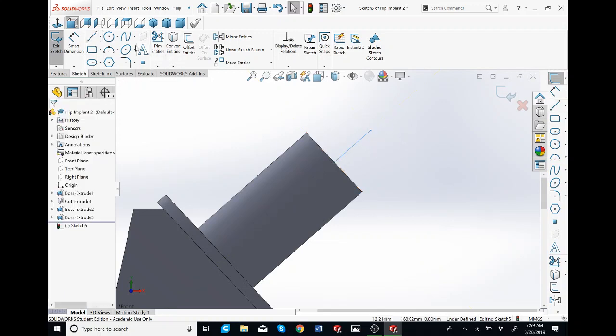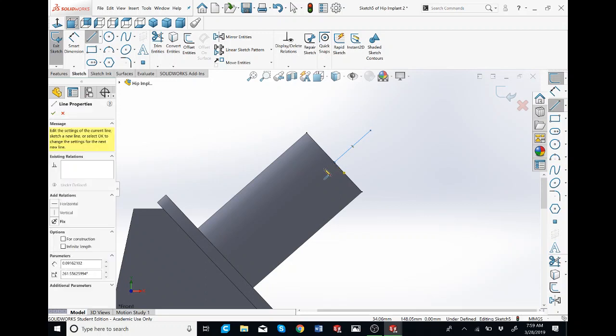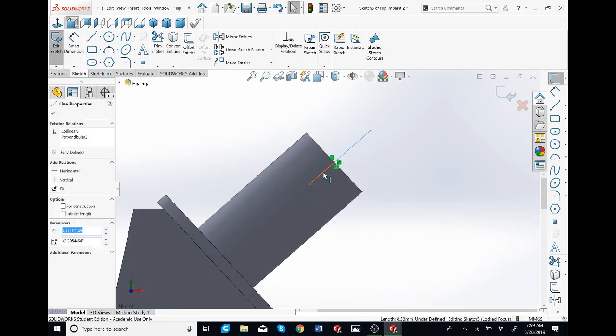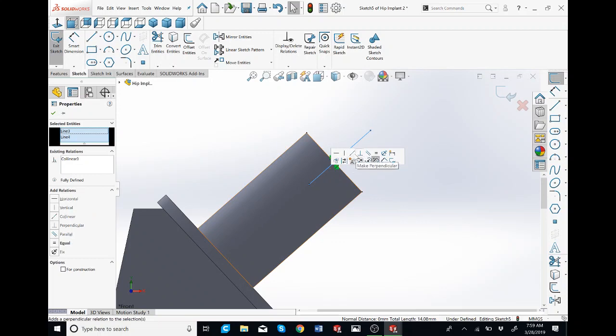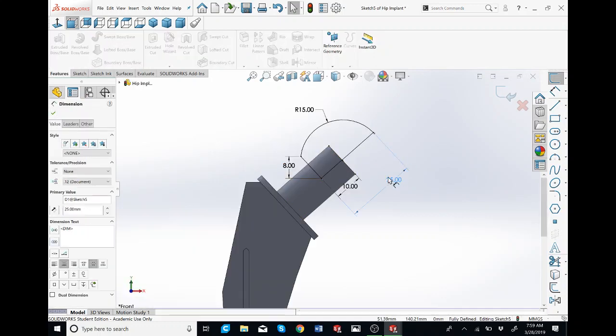Escape to get out of it. Click on line again. Connect it to the same point we did before, and you see another yellow line. And just click here. So now it's the same as this. If it doesn't show the yellow line, you can click on this line, hold Control, click on this line, and then make it collinear on this menu. So I'm going to go back to see the dimensions, 25 and 10.